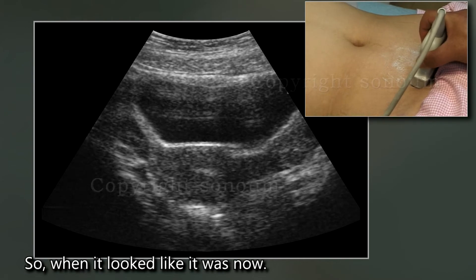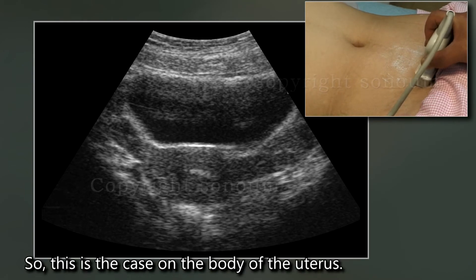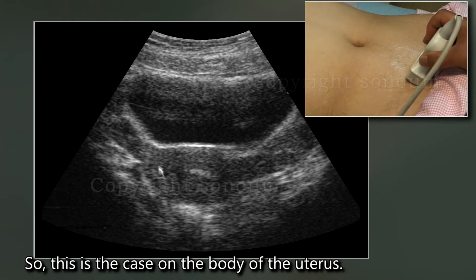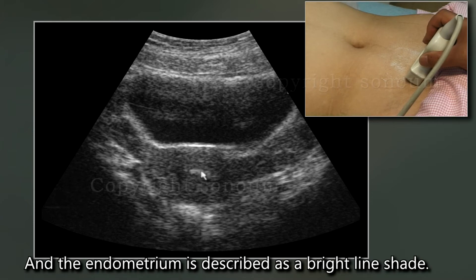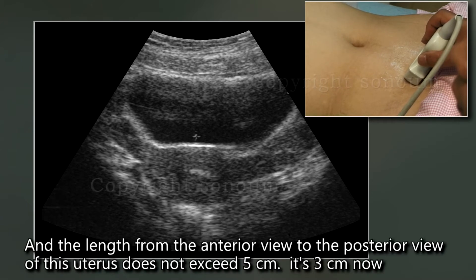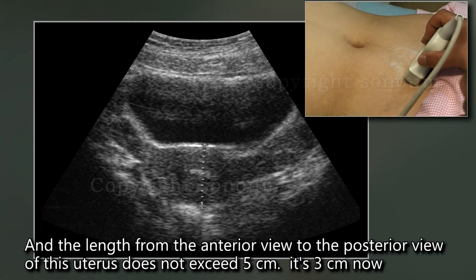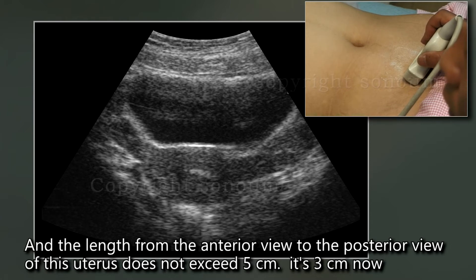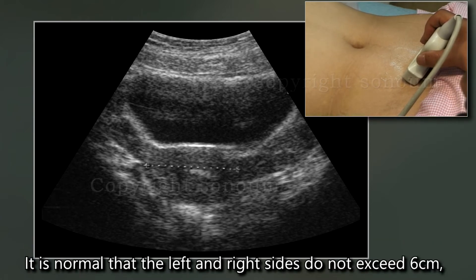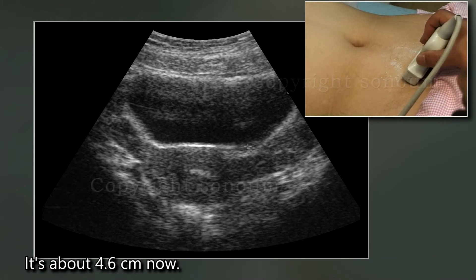This is the body of the uterus. The endometrium is described as a bright line shade. The length from the anterior to the posterior view of this uterus does not exceed 5 cm — it is 3 cm now. The left-right measurement should not exceed 6 cm; it is about 4.6 cm now, which is normal.